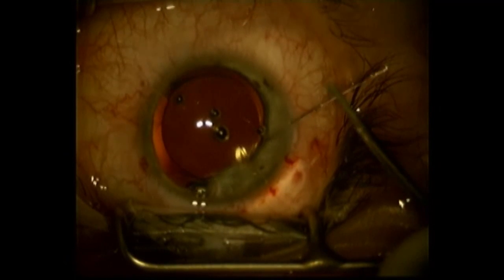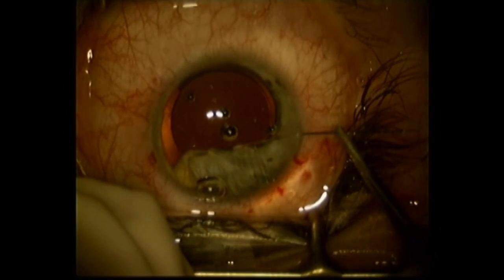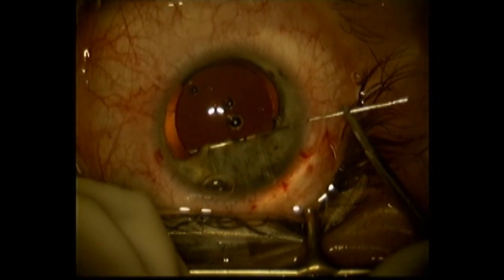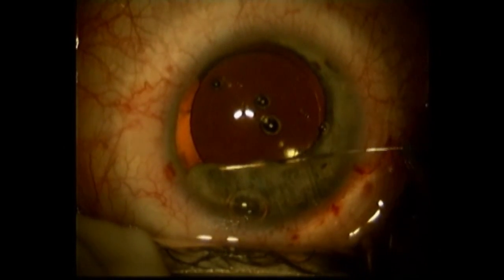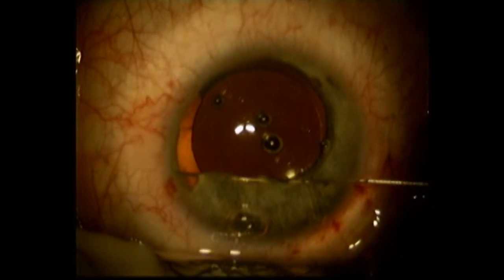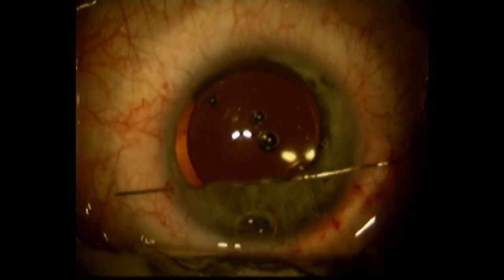This is a straight needle attached to a 10-0 polypropylene suture. Being very careful here to create this cerclage or purse-string effect without putting too much stress on the iris.